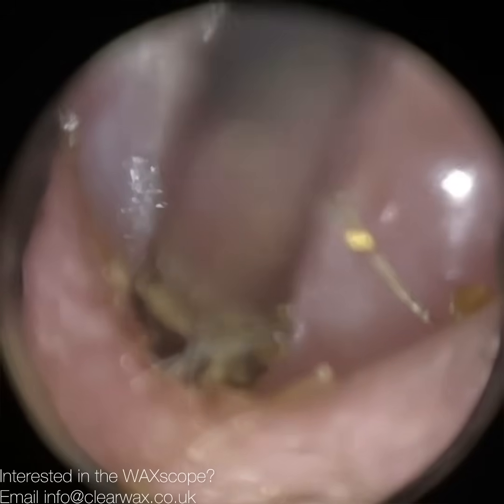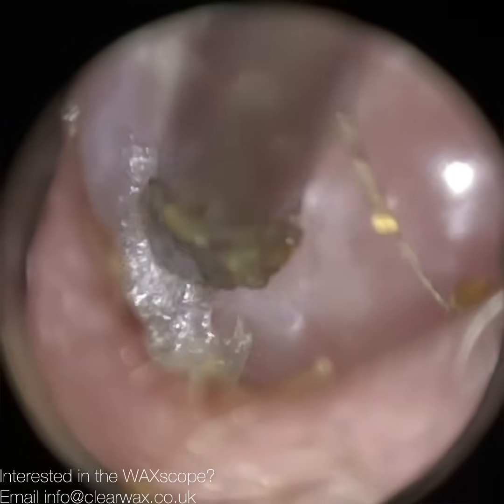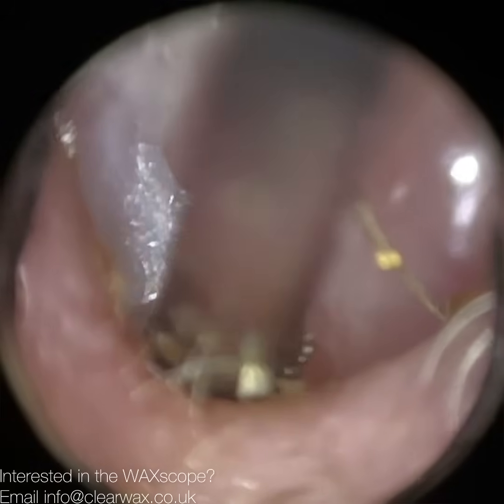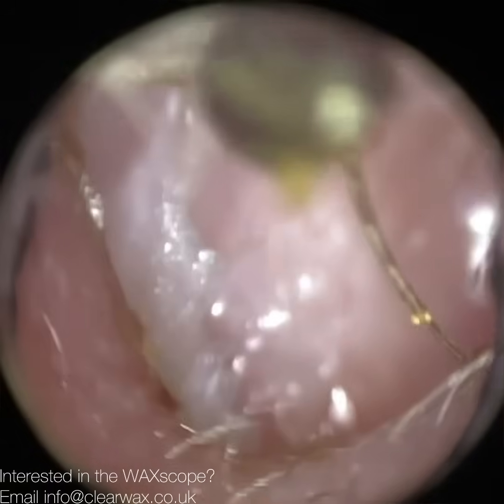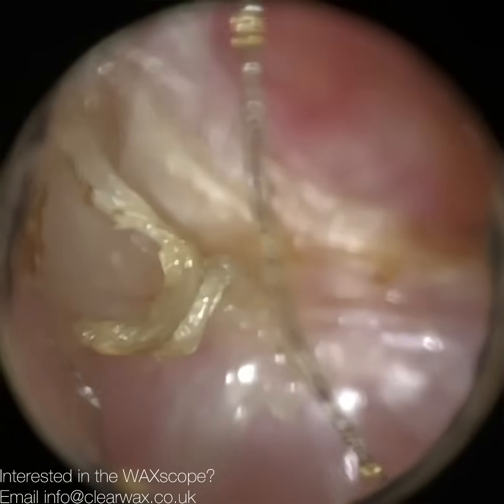So initially suction was performed with a standard Zollner size suction probe, but for more delicate work like this and the skin peels, I'm just using the fine end. It just gives you a bit more precision, a bit more control, it's less noisy. It works better with skin actually.